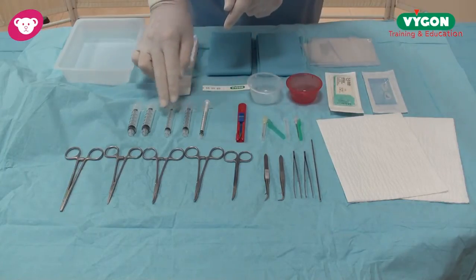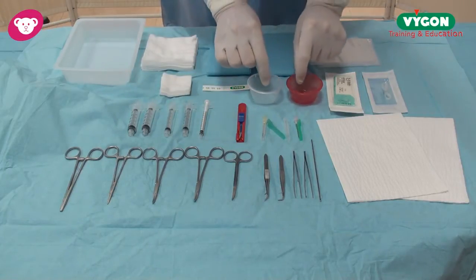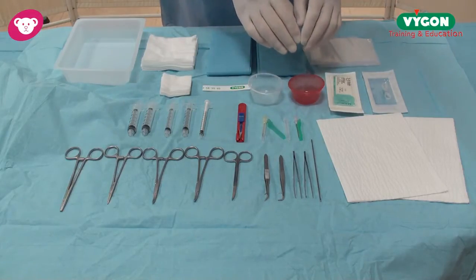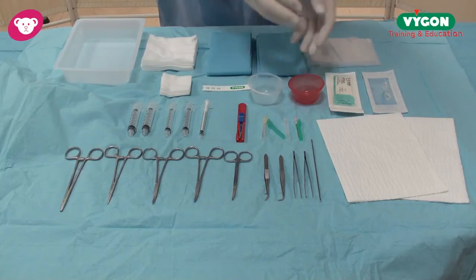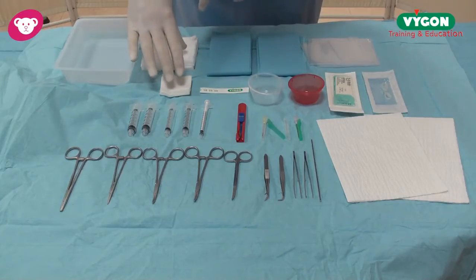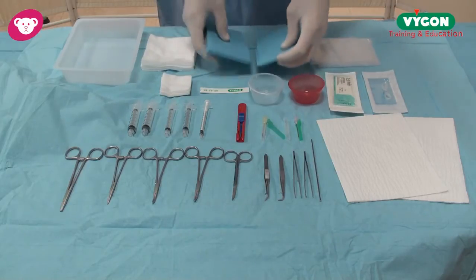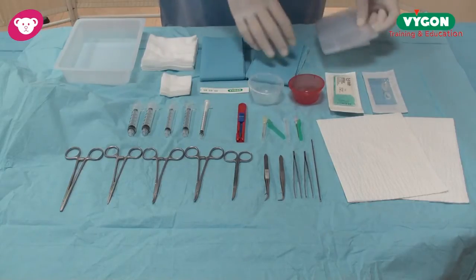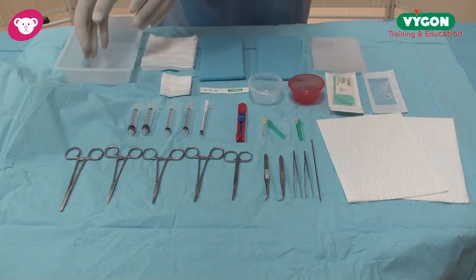We then have a selection of syringes with luer lock. We have two galley pots — one red one, one clear one. The red one is designed to take the cleaning solution, so there is no risk of mixing up solutions when cleaning and injecting. We have a tape measure, a selection of swabs, and very importantly we have two surgical drapes, plus our unique splitting drape which I'll show you in a moment, and we have a receptacle here to take all the waste items.